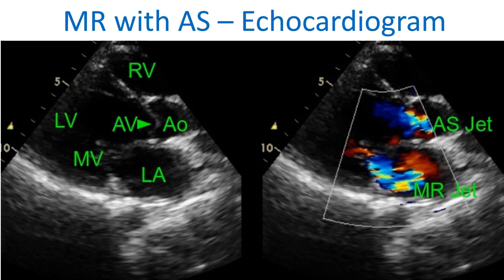RV: right ventricle. LV: left ventricle. AV: domed stenosed aortic valve in systole. MV: closed mitral valve with systolic separation of leaflets causing mitral regurgitation. LA: left atrium. AO: aorta. AS jet: mosaic jet of aortic stenosis in the aorta, preceded by flow acceleration in the left ventricular outflow tract. MR jet: aliased mosaic jet of mitral regurgitation in the left atrium, starting from the closed mitral valve with a little systolic separation of the mitral leaflets.